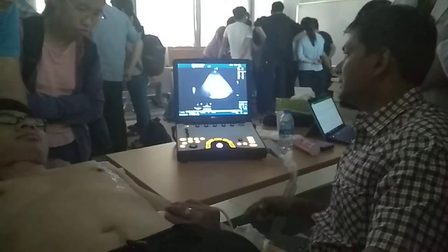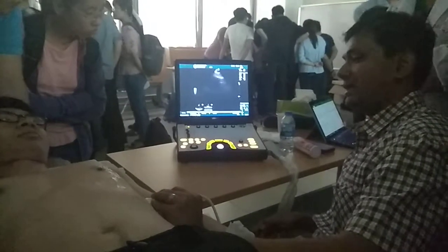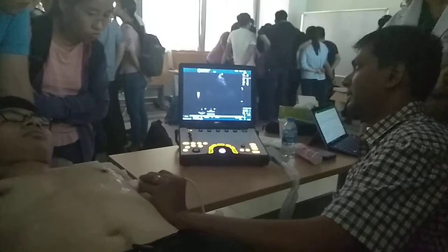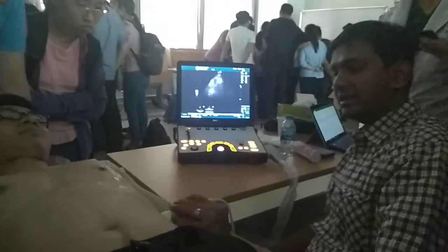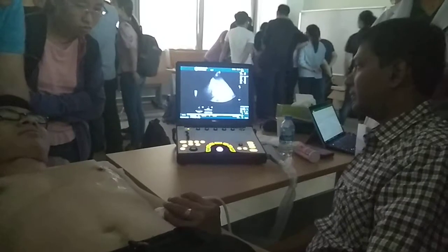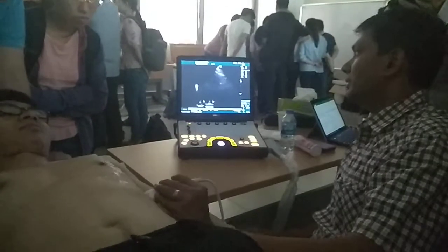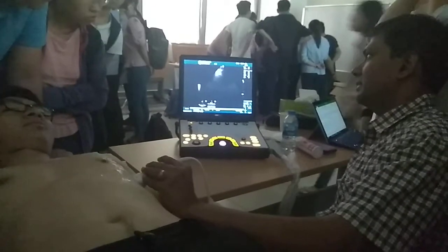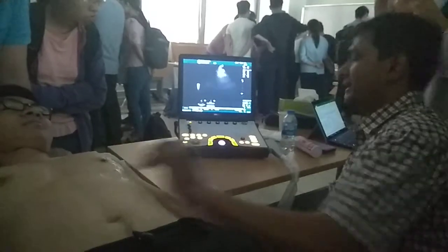So now spleen, lung. I'm going medially, lung, so no heart here. Come back, go more medially. Spleen, and now I'm searching, only lung. So no heart again.